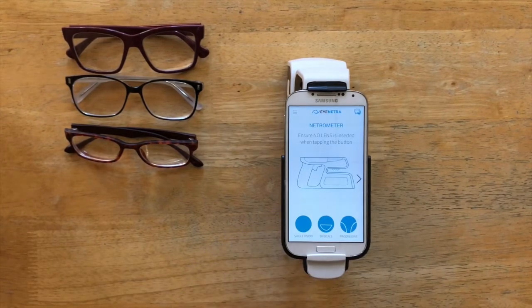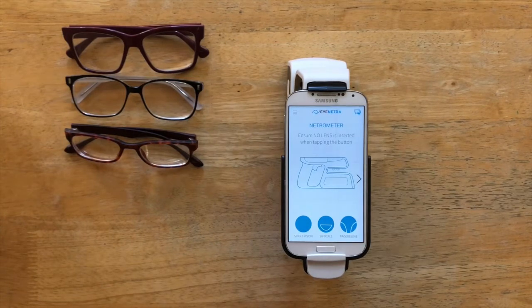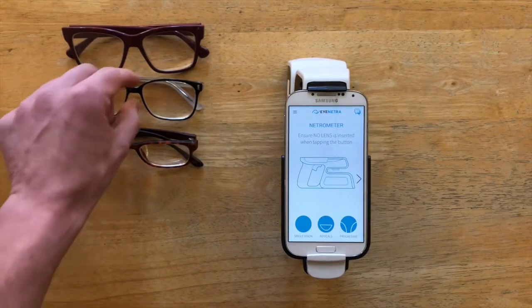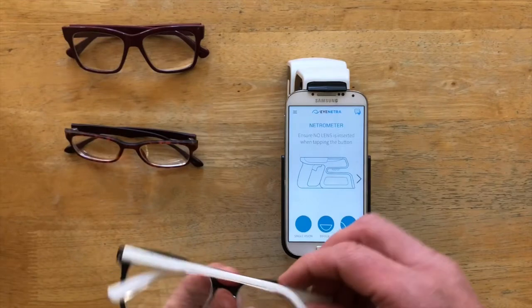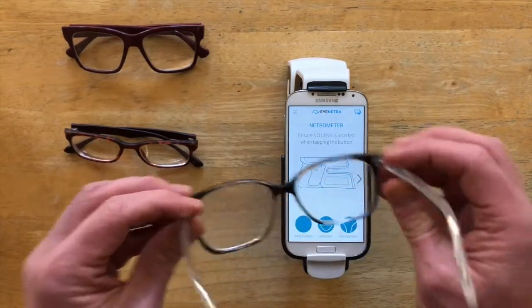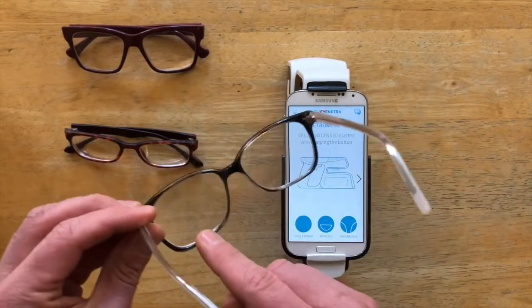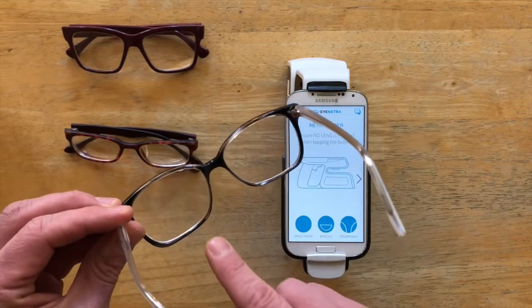Now with bifocals and progressives, the process is pretty similar. There's just two readings per lens instead of one. And the most important thing with multifocals is you just want to make sure you're reading the appropriate region of the lens. So we're always going to read the distance portion first, and then the add value.